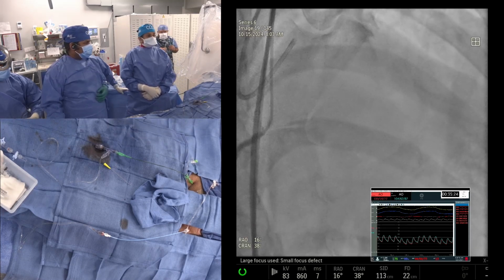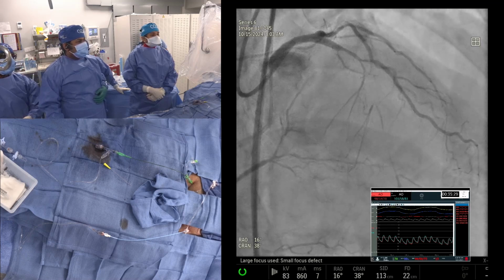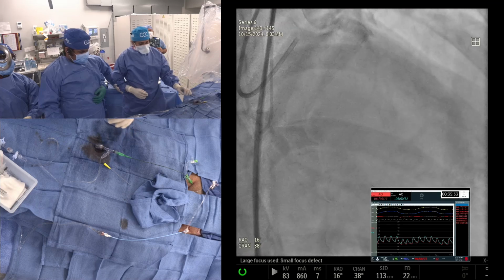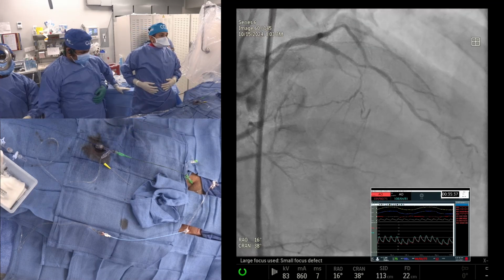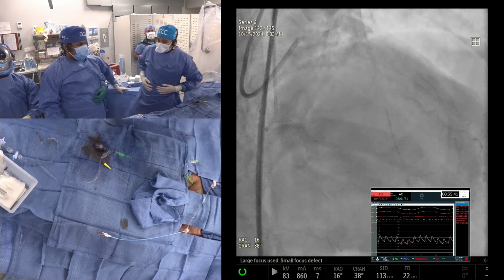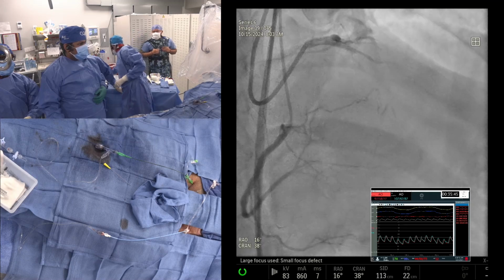go with Miracle. Clearly, this here does not look like calcium. The earlier angiogram appeared to, but there's no calcium here. Okay, we go to click present. So what is your choice? As soon as you bring your catheter there with a Fielder, what is your next wire you're going to ask for? I will go with Miracle. But if somebody says they want Gaia 2 or 3, that's okay too. Go with Miracle 6.